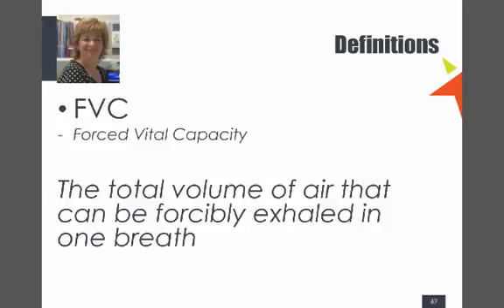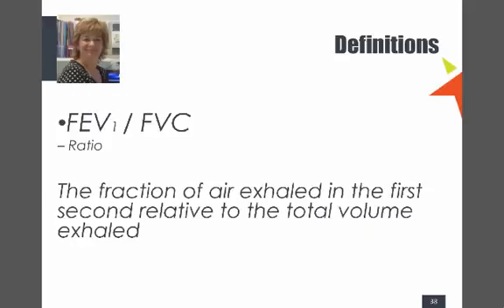Your forced vital capacity, that's how much volume you can get out. So that's telling you about have you got any restriction? Have you got any reduced volume? That's what we're looking at when we're looking at restrictive type things.